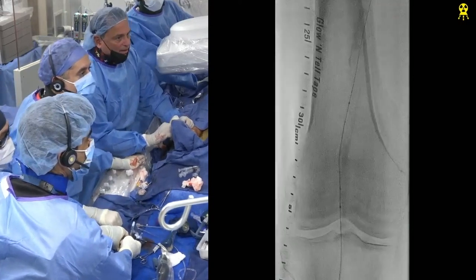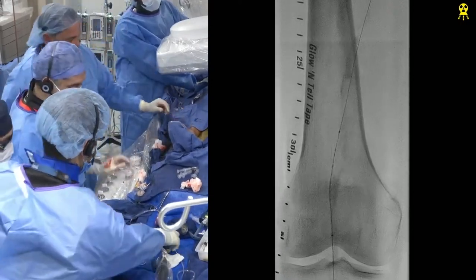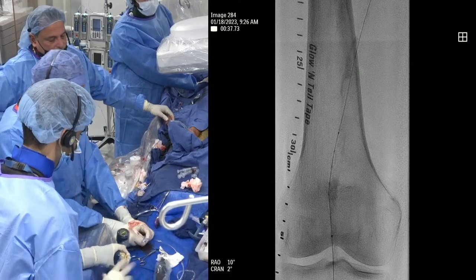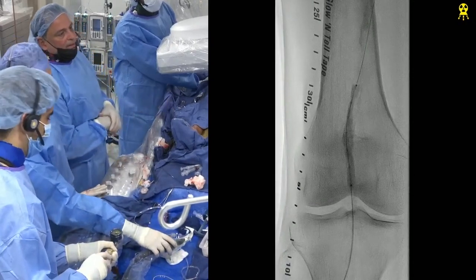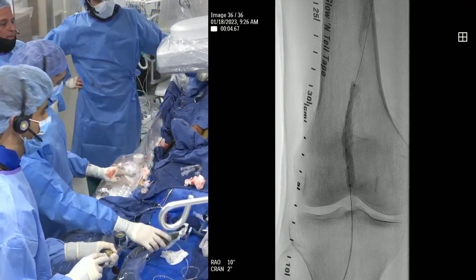See, this is why, Karthik, I didn't want to lose the through and through wire, brother. Let's go up. Yeah. Go forward. Go up. So even with the through and through wire, we can't get this up. Okay. Forward. Go. Good. That's quite impressive.